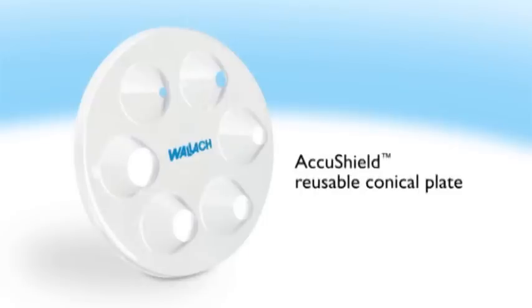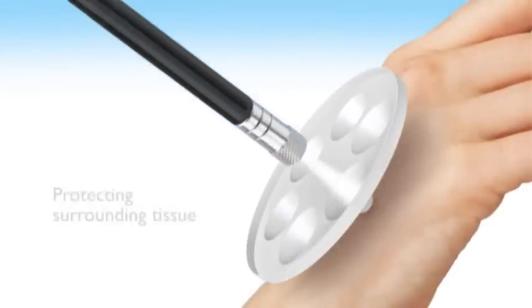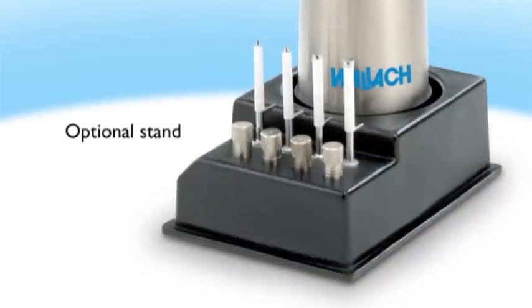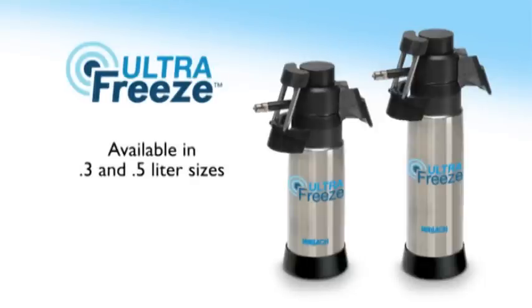The AccuShield reusable conical plate, with six openings of different sizes, is available to help concentrate the spray in the target area, protecting surrounding tissue. An optional stand helps keep the workspace organized. Wallach UltraFreeze is available in 0.3 and 0.5 liter sizes and has a three-year manufacturer's warranty.